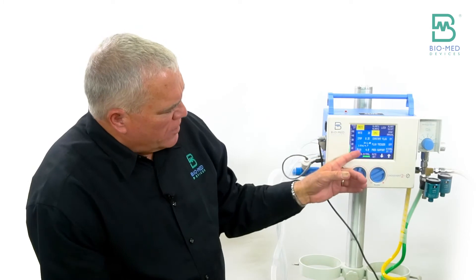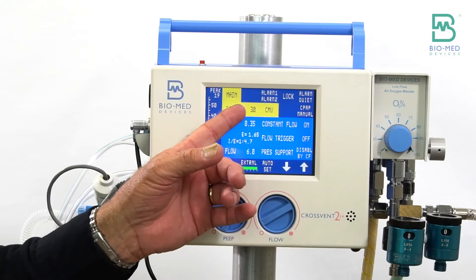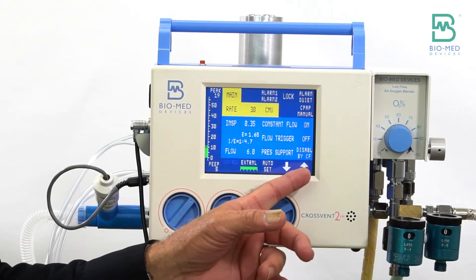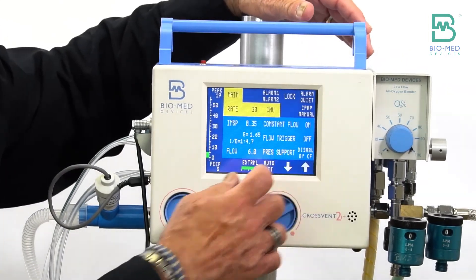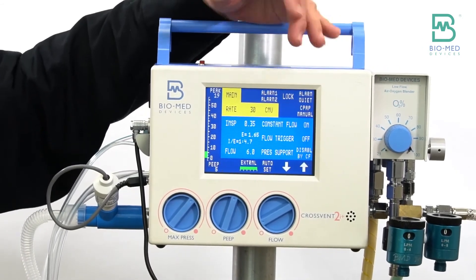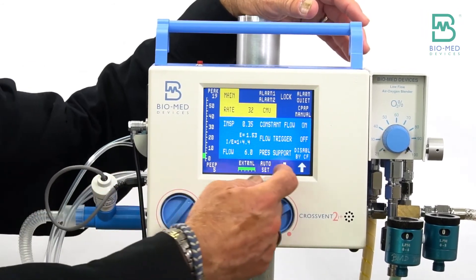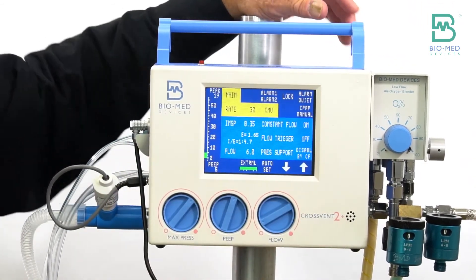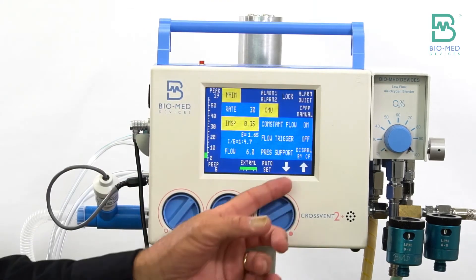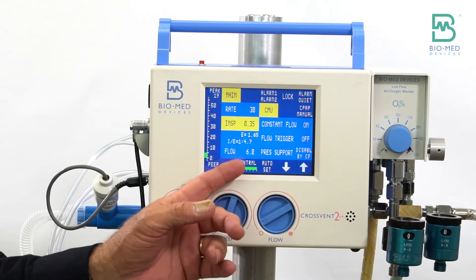As far as the touch screen keys go, if you work your way down and highlight rate, you can change it with the arrow keys up or down. One thing to note: most ICU ventilators today will have you confirm that change, but if I make a change here to 32, it's changed immediately. Inspiratory time can be set in 0.05 increments up or down. We already set our flow.